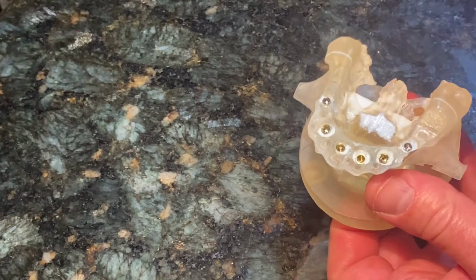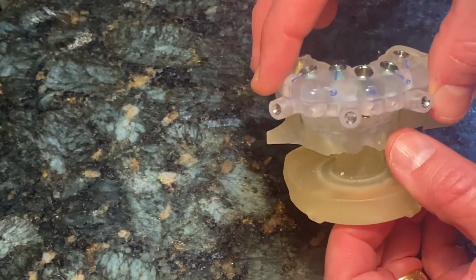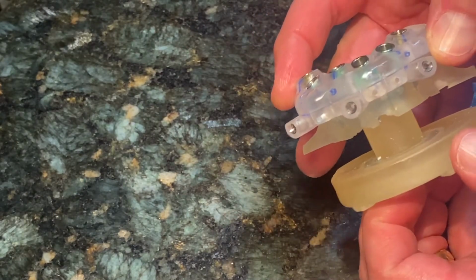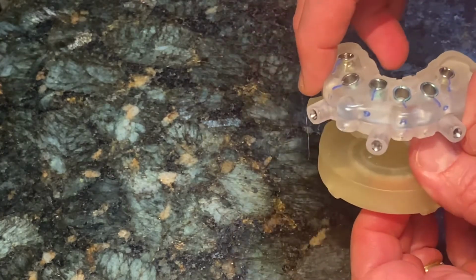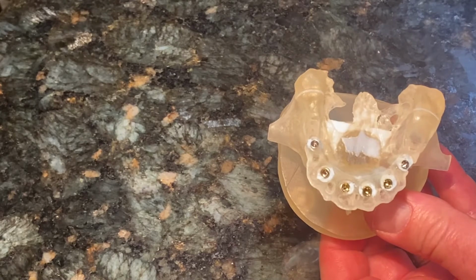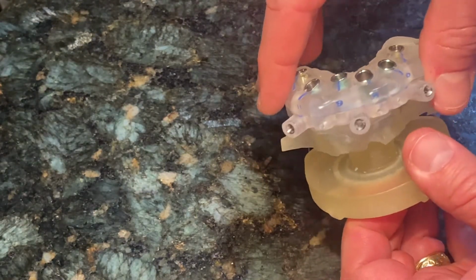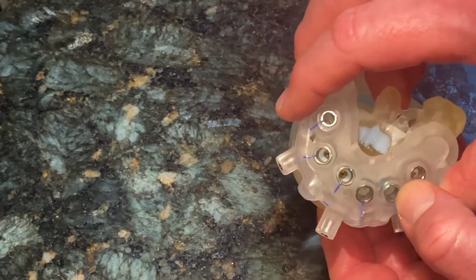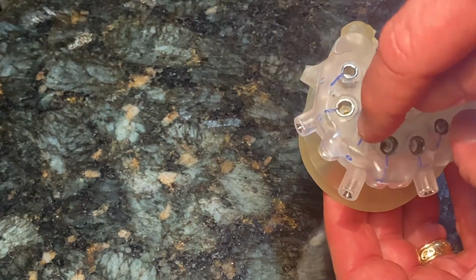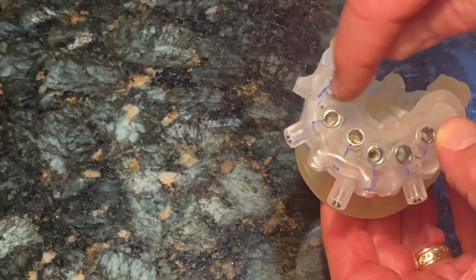This is the implant guide or implant stent. It fits perfectly in the mouth, and it guarantees that the ideal implant position determined on the model gets transferred perfectly to the mouth by the implants getting placed through each guide hole in the stent.